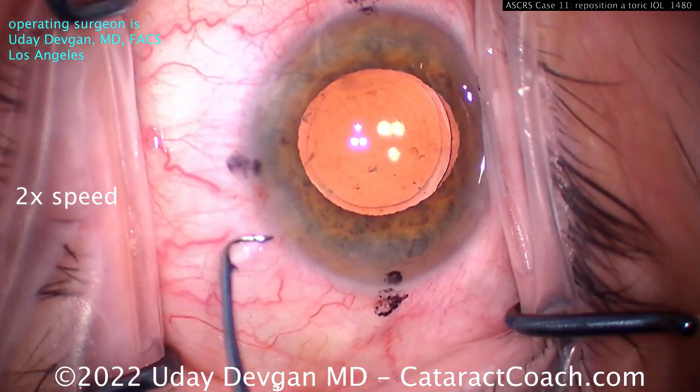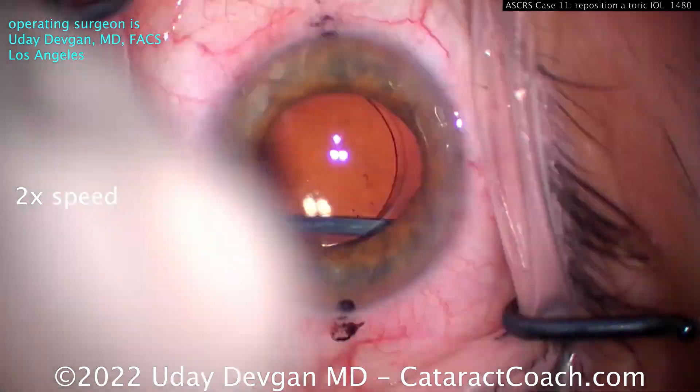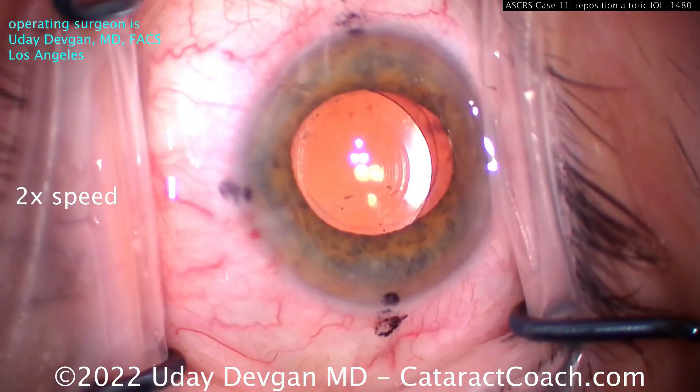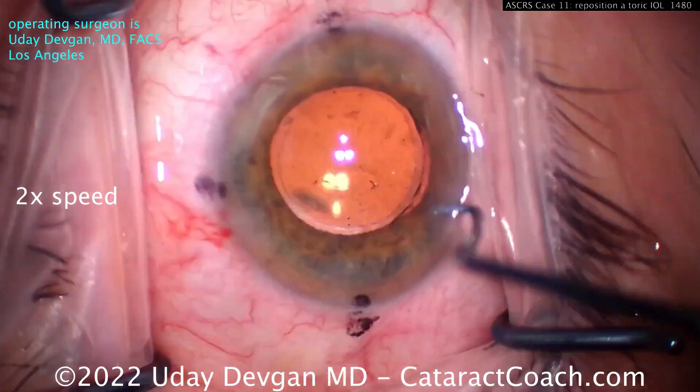We've freed up one haptic, but the other haptic is still stuck. Don't force it. Use the spatula again to break those adhesions, which you can't see because there's the capsular bag equator. Once those adhesions are broken, the lens can be rotated.